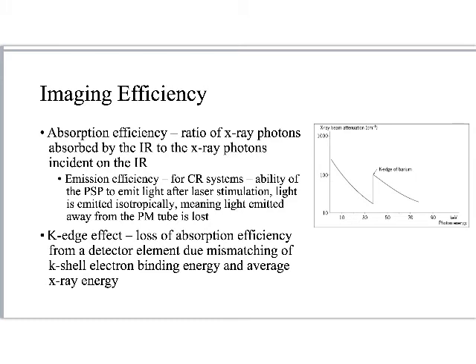And it just kind of stands to reason. If it's not getting all of the X-rays I'm giving it, then it's not very efficient, either in some part of the crystalline structure or in some part of the TFT, whether it's a CR or a DR system, doesn't matter. I would say that it's lacking some absorption efficiency.